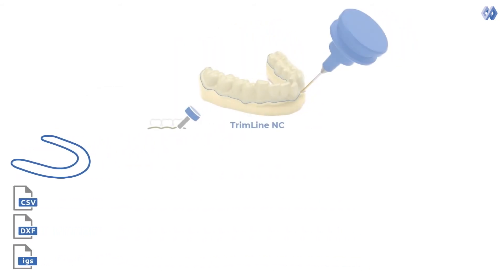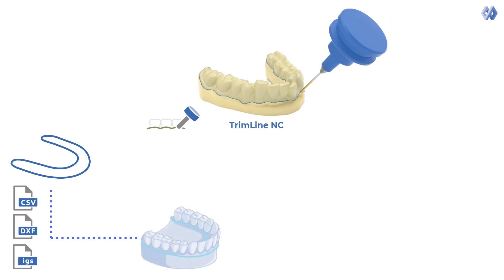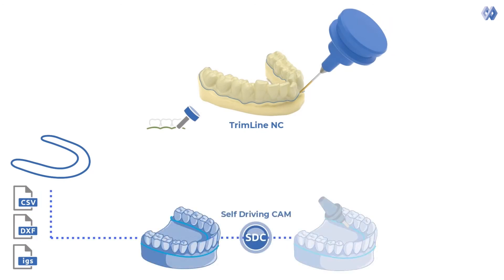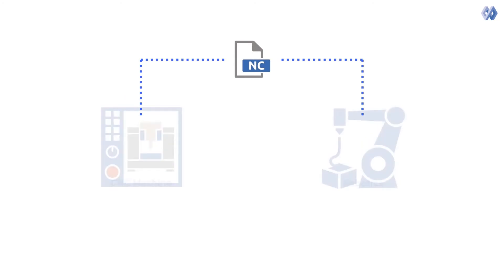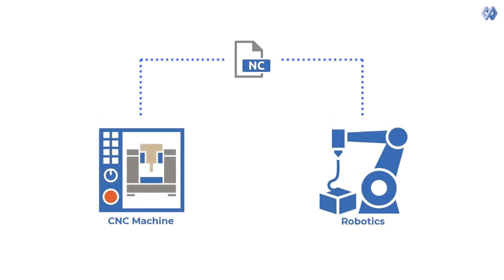Clear Aligner Trimline NC then automatically calculates the most efficient 4-axis or 5-axis trimming collision-free toolpath and exports the NC file. Trimline NC can generate NC code for either CNC machines and robotics.